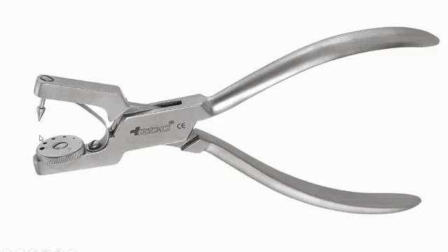तो इट्स वेरी सिंपल. हाँ, it is very simple to decide for which tooth you want to punch depending upon the mesodistal dimension of the tooth you are isolating. Mesodistal and for maxillary molars, buccolingual also. So it's very simple. तो ये जो रिंग होता है रोटेटिंग होता है, तो आप शीट को जस्ट इसके अंदर रखोगे एंड डिपेंडिंग अपॉन द टूथ, फॉर एग्जांपल मल्टीपल टूथ का आइसोलेशन कर रहे हो तो you may have to use different holes. सिंगल टूथ का आइसोलेशन कर रहे हो, मोलर्स कर रहे हो तो this or the 4th one you can use. So it's a very simple funda.